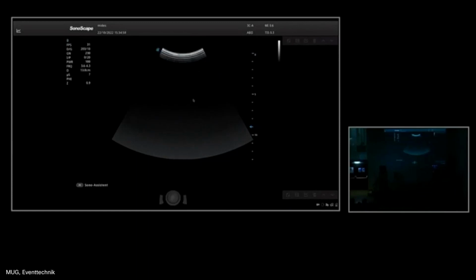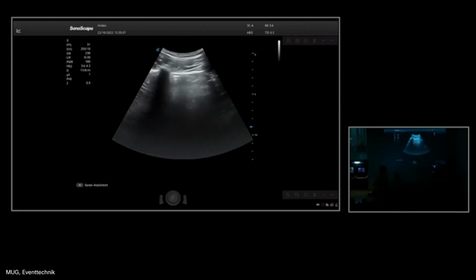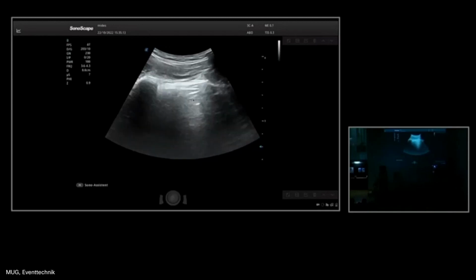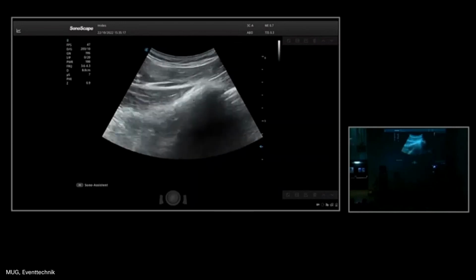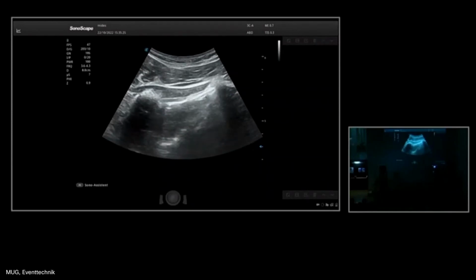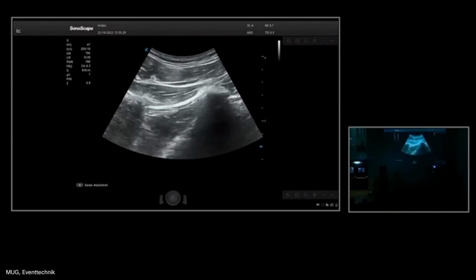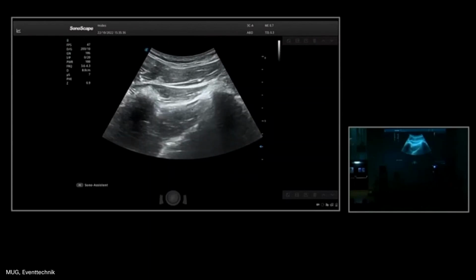We are going to look at the pleura, whether there is pneumothorax or not. So in this situation, I am going to do a little adaptation to my ultrasound settings, because I really need to look at this pleural movement a little bit better. And you see this Ameisenlaufen, or ant-walking movement of the pleura. B lines, sometimes you see one or two lines, but you see the movement.